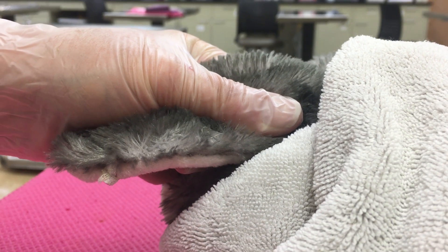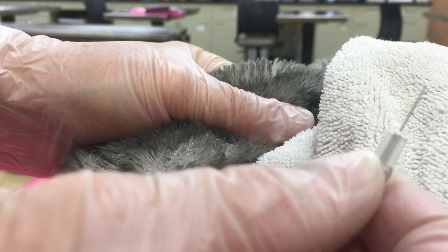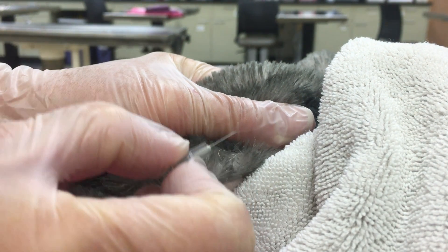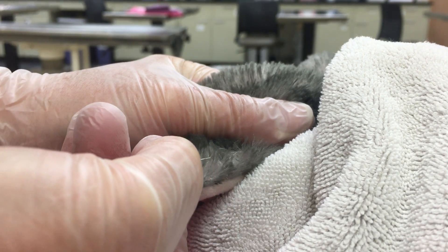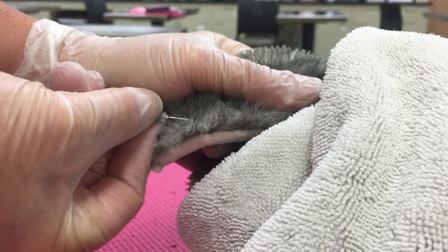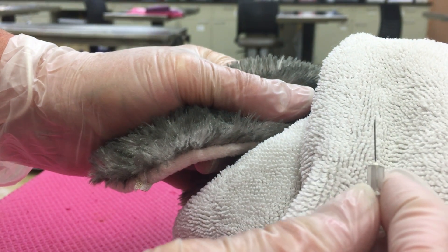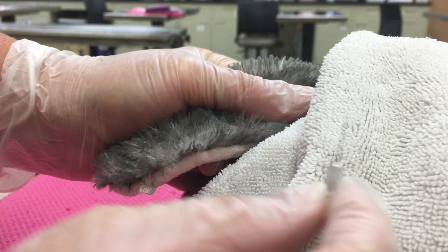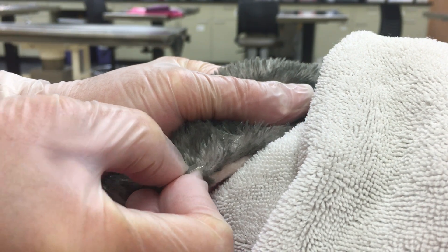Then I'm going to hold the needle — and this is key — I want to hold the needle so the bevel is up, but I want to hold it flat on the ear. I don't want to go over the top of my finger. Can you see how that needle has to go at a much deeper angle when it's on the top of my finger? I want to hold that needle flat, so I'm going to hold it on either side of that hub so I can lay it flat on and then just slide it in.